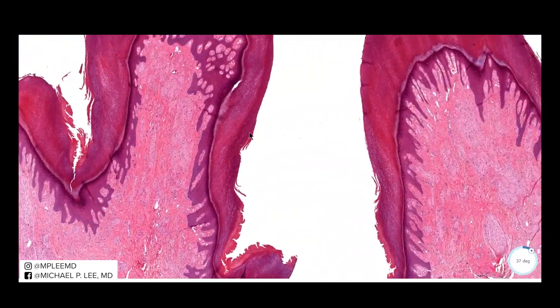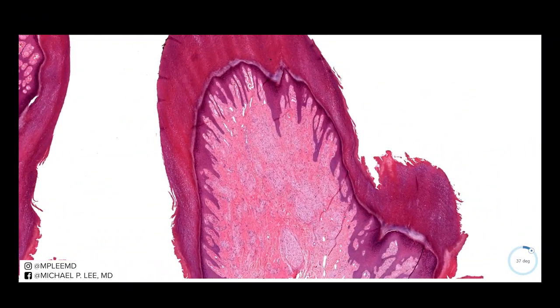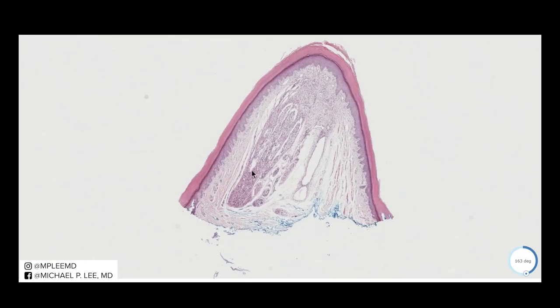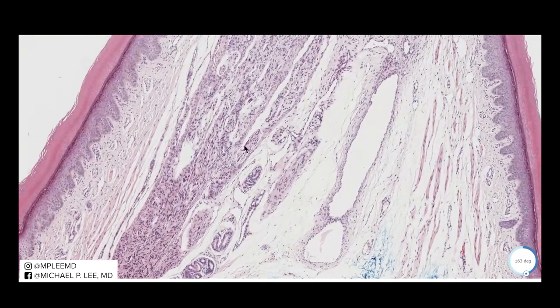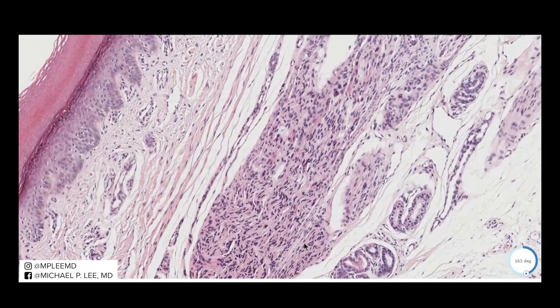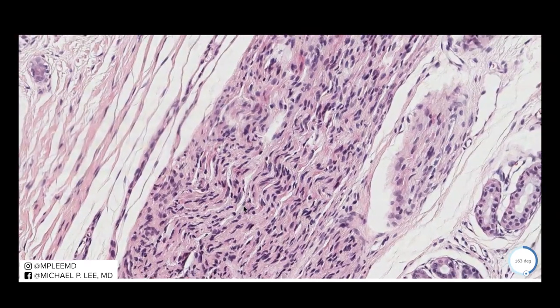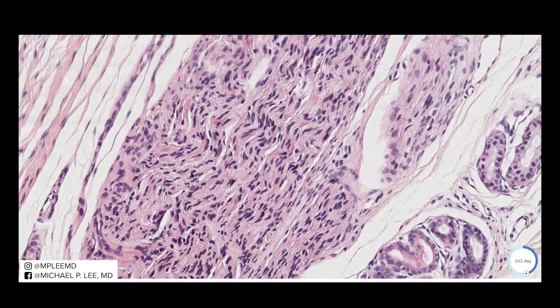We have another example here — a similar kind of picture. Orthohyperkeratosis; we can tell that we're on acral skin, and the central area here is pretty busy. That busy area again contains wavy nerve fibers, and here you can actually make out very nice wavy nuclei.